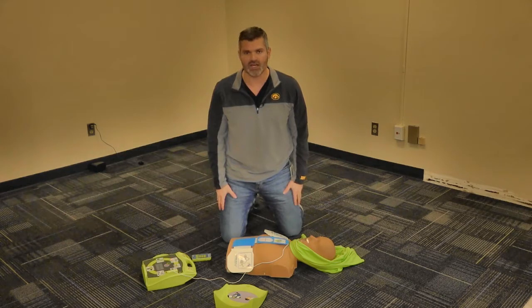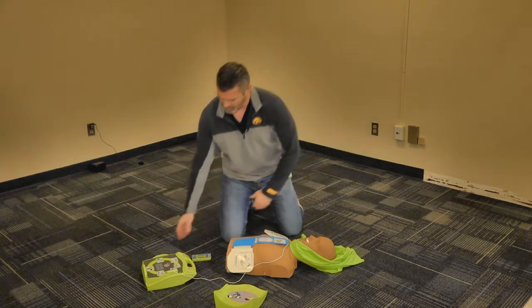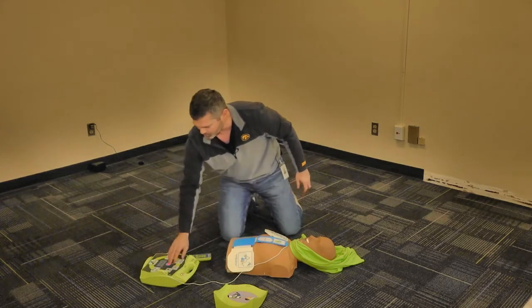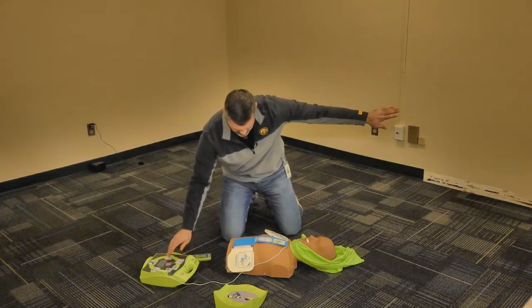Shock is advised — don't touch the patient. Press the flashing shock button. We're going to press this flashing shock button to administer the shock. Clear. Shock delivered.